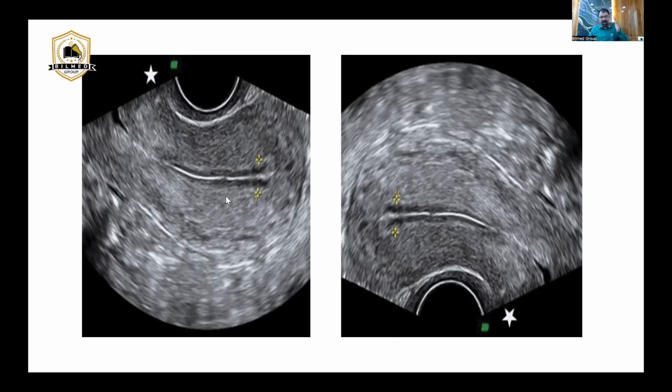In hepatitis, it is the length which is mostly increased. And in fatty livers, for example, it is the anterior posterior which is more increased.